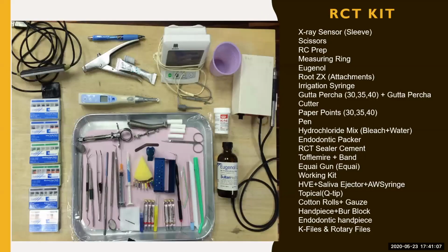Here is a picture of an RCT kit. It consists of multiple things, so please make sure you have all of this available to the doctor before the RCT treatment has begun. Thank you.